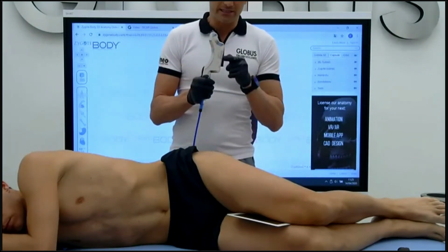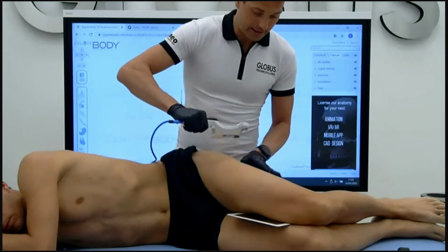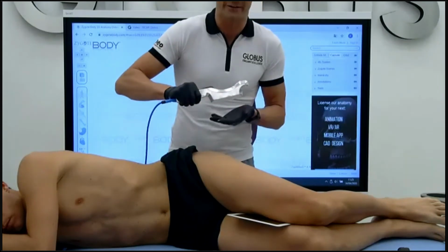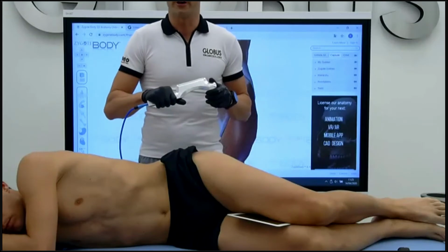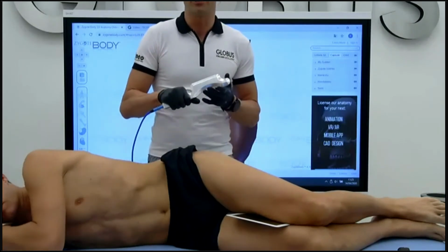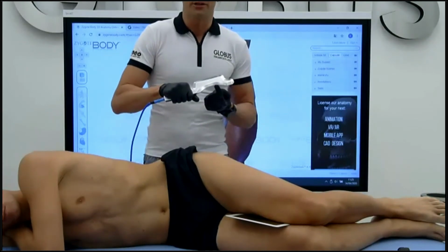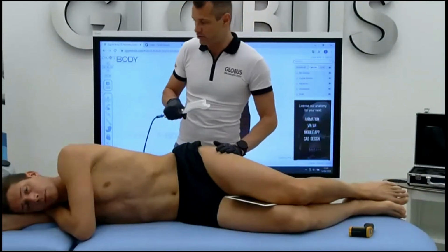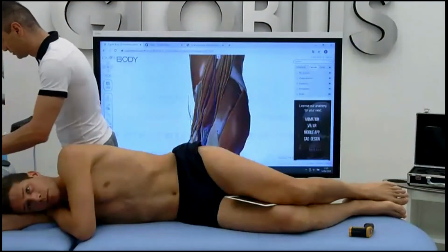In this case, if we connect the tool on this rounded surface, the pressure for each square millimeter is lower. So, regarding also the question of reducing the petechiae and the damage on tissue, we can easily use this edge to be sure that it is a very gentle and homogeneous treatment on the skin and on the fascia lata. So I put a bit of cream.